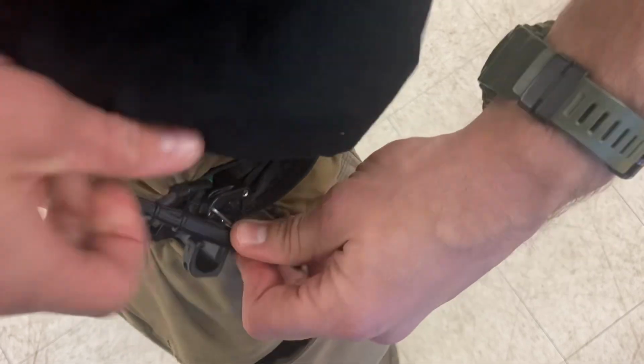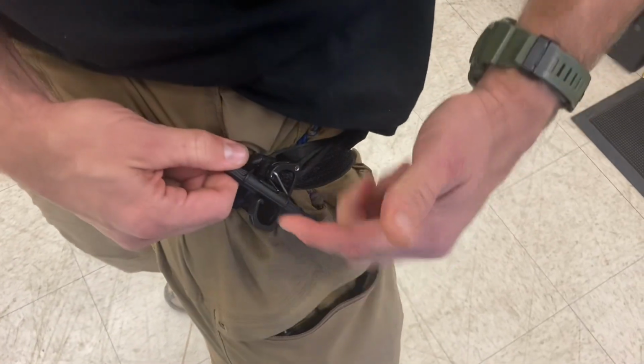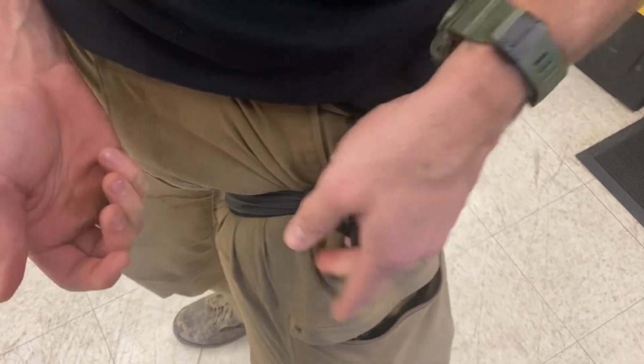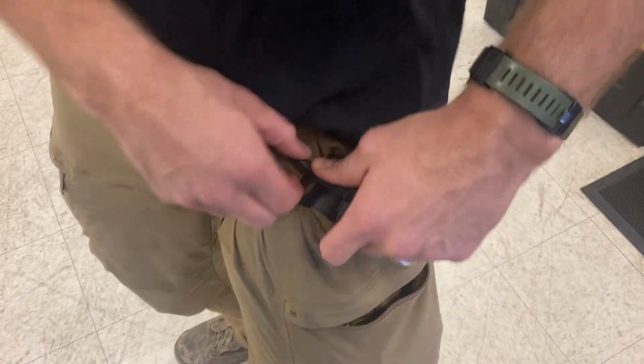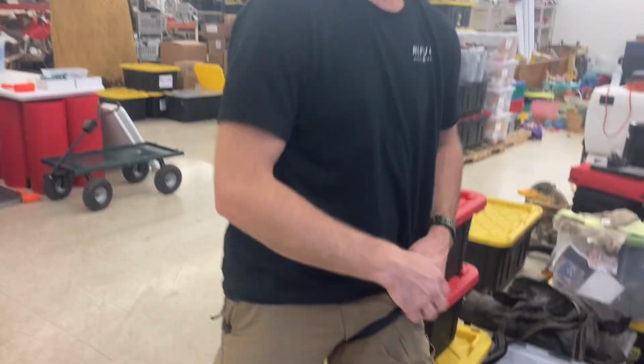Okay. And now I have that same dilemma I did a little bit ago. It's not going to hook because now this center section's too close to your clip. Yeah, and now it's just going to come undone. I got it hooked, but again, I wouldn't rely on that tension there. I needed that one more turn. Okay, so final thoughts on it.